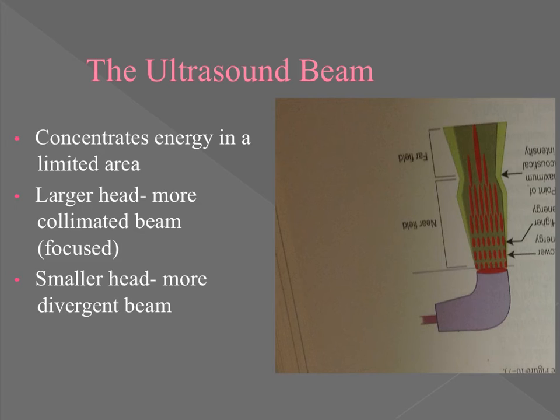So what we know about ultrasound energy is that it concentrates energy in a limited area, right? We know about larger head treatment. Devices that have larger heads are going to be more collimated. In other words, it's going to be more like a beam. It's going to be more of a focused treatment. So larger heads lead to more focused treatments.